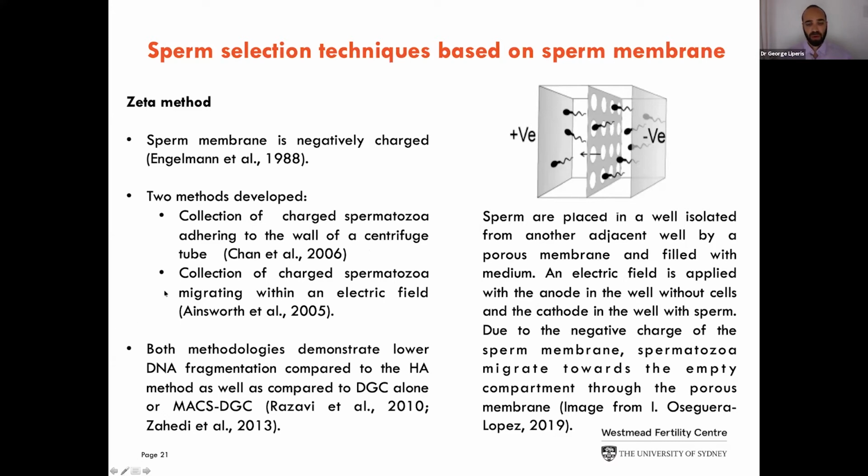Both methodologies have been shown to retain sperm with lower DNA fragmentation compared to hyaluronic acid methods, as well as compared to density gradient on its own or MACS with density gradient.